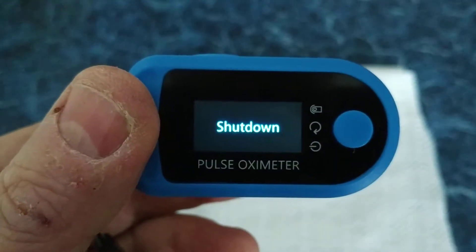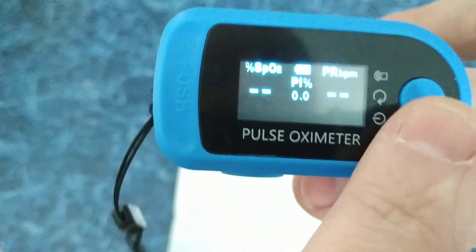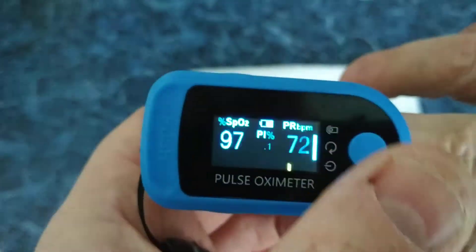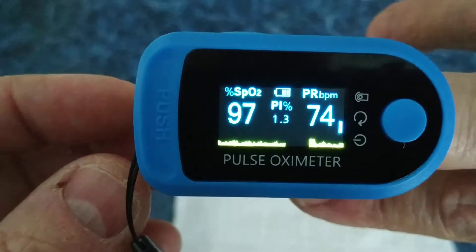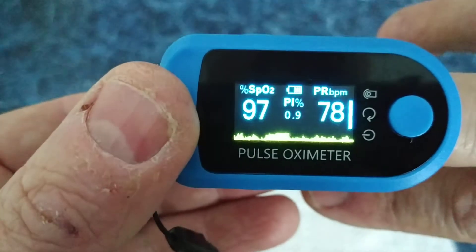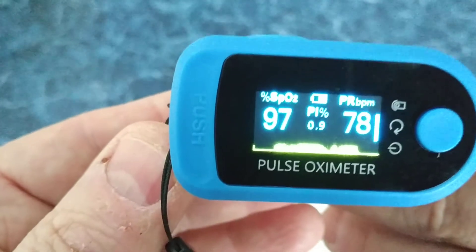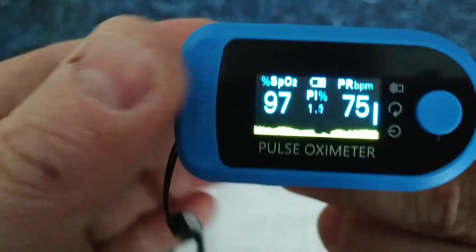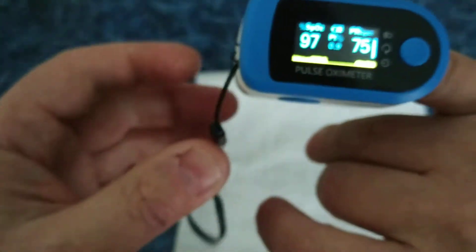Let's take out the finger and put in a second one. Press the button again. We have the same 97 level and 74-75 BPM. Let's take another one. Same finger — also 97. The small finger, and it's also 97.